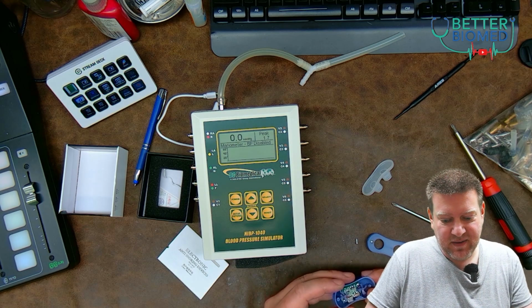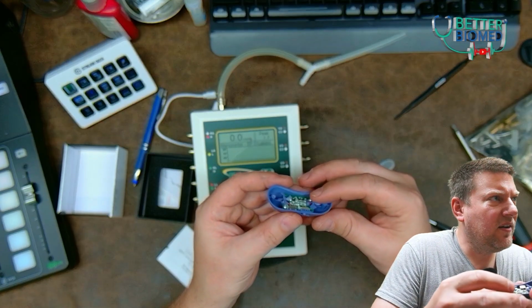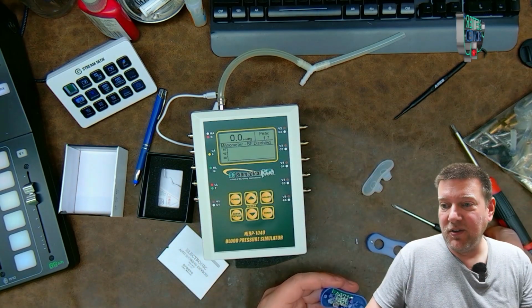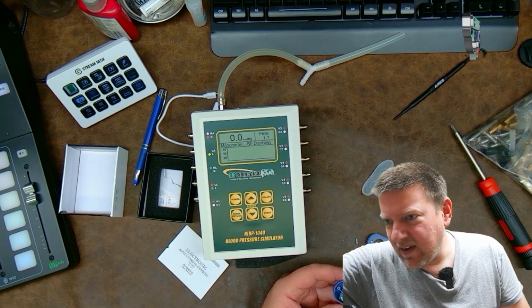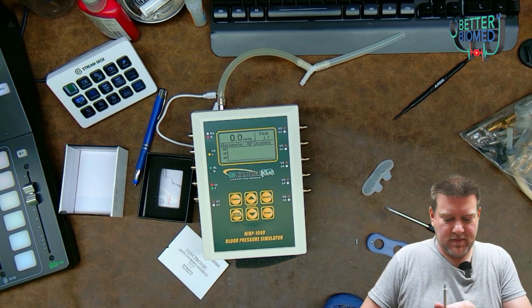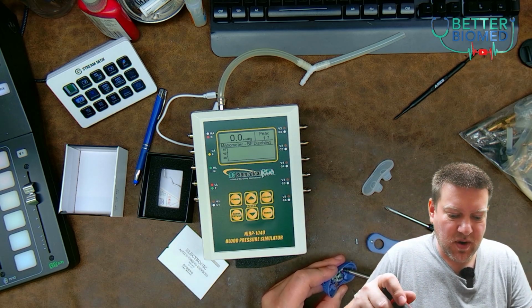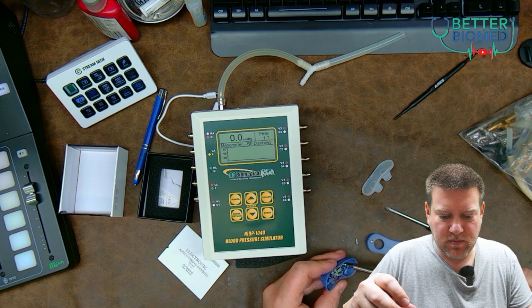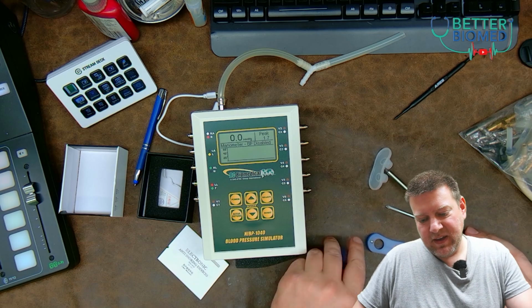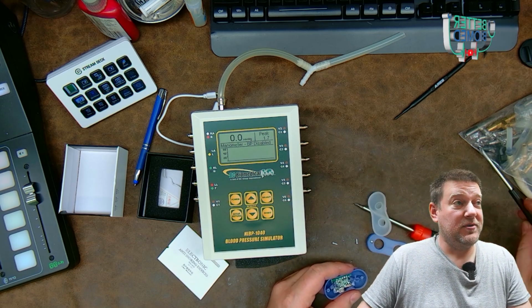All right, and we have two tiny little brush motors right there. See the two little fans, a tiny little controller, and let's get me a smaller Phillips. There we go. Let's just go ahead and pull it all apart. Now, here's the thing. This product here, do you really want something like this crammed up your nose?